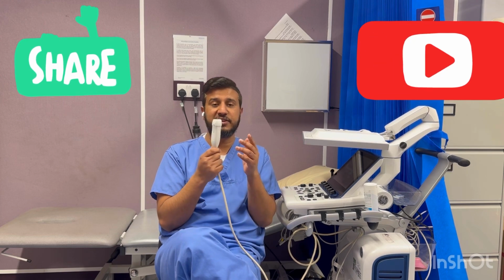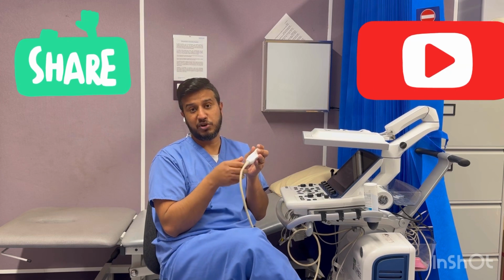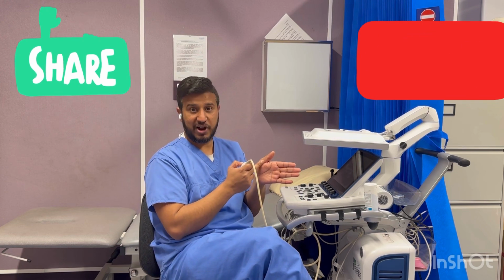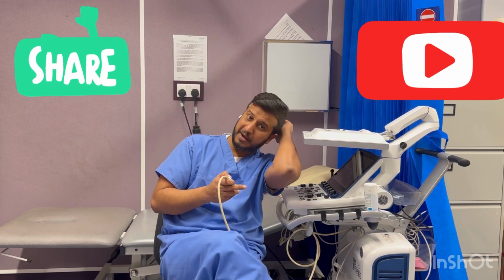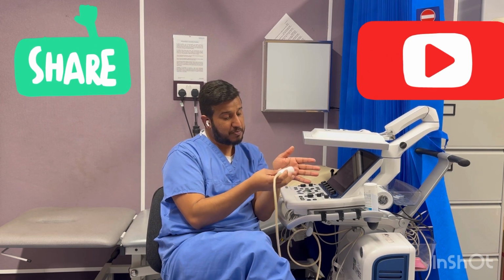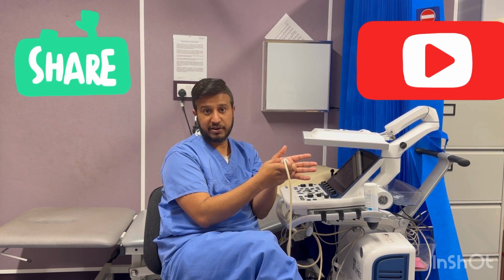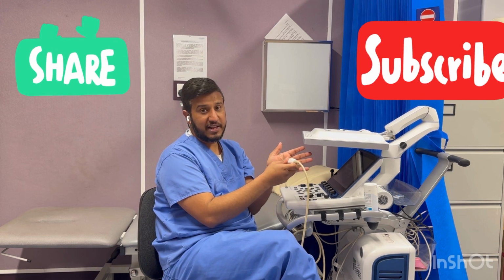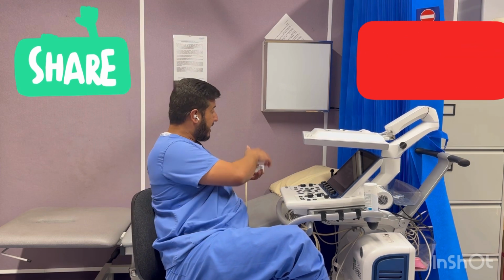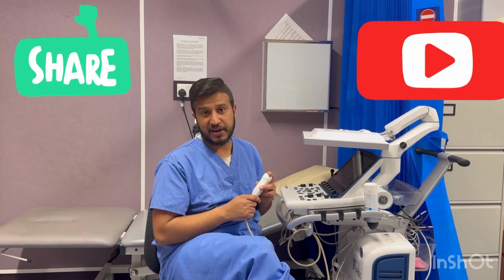Parasternal long axis means that you place the probe on the patient's chest in a longitudinal position. For example, this is your patient lying, okay? This one is the patient's right shoulder. Like the patient will be lying this way, so this will be the patient's right shoulder, and this is the chest. So you place the probe this way, like your marker should be facing towards the right shoulder of the patient, okay? And you will be getting the images this way. When I will be doing it, my probe will be like this. Marker should be towards the right shoulder of the patient. So this is how you are going to get the parasternal long axis.